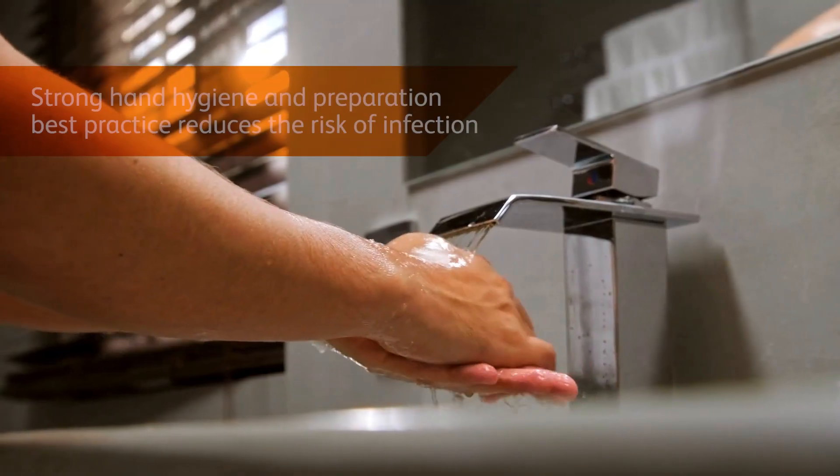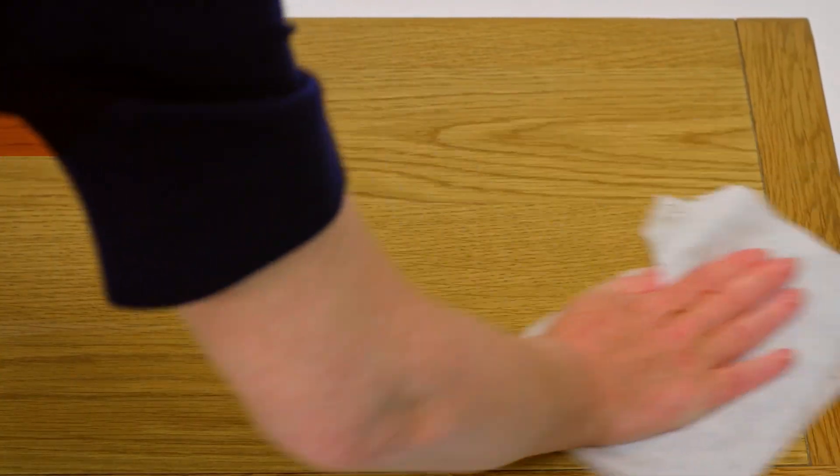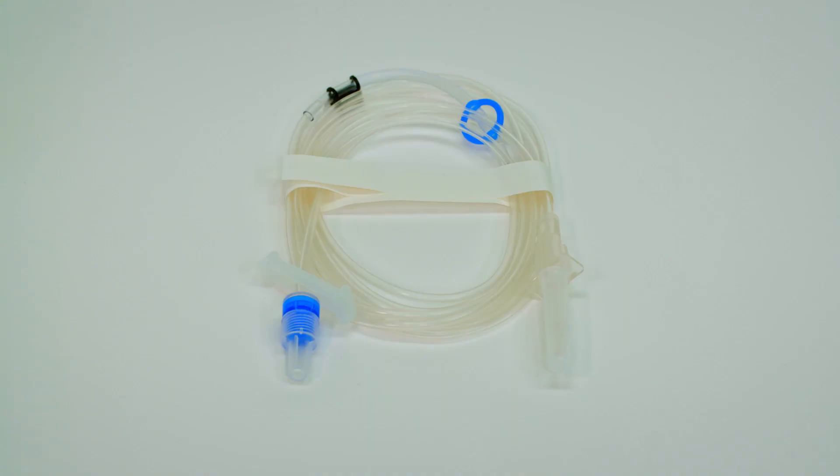Good hygiene and the preparation of clean work surfaces is the first crucial step to reduce risk of infection. Remember, your infusion line may have direct access to your venous system, so allow the necessary time for preparation.